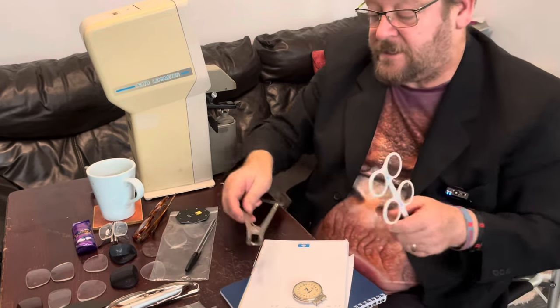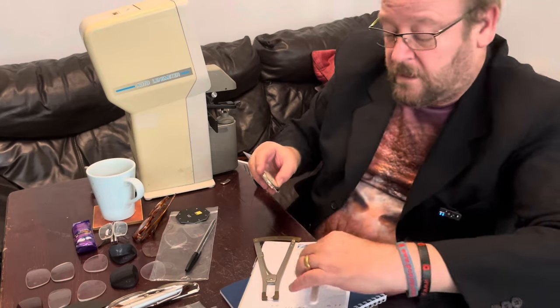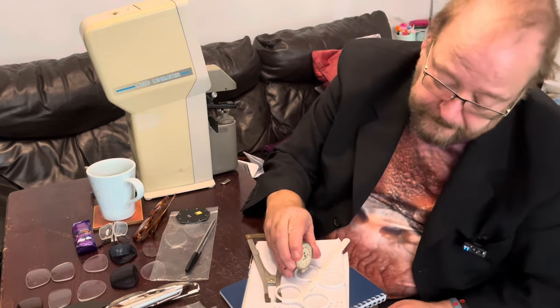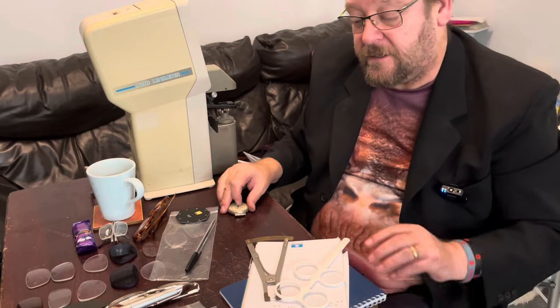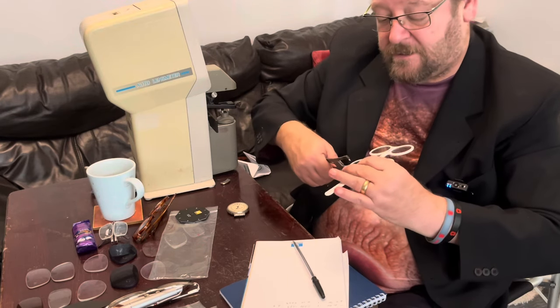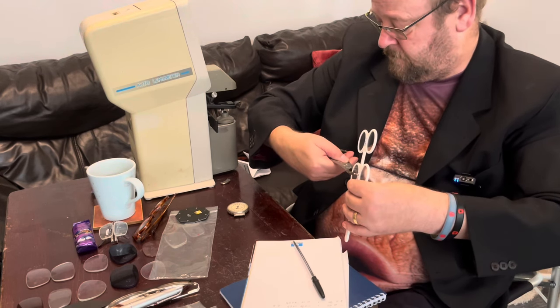Now I'll do the same measurements on the plus side. If I have it pointing towards here, you can see that's plano on the front and plus 0.25 on the back. And just checking the center thickness of the lens on the plus side — that's 2.8 millimeters thick.